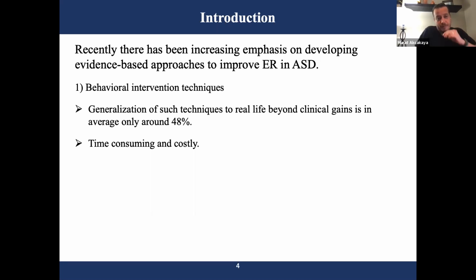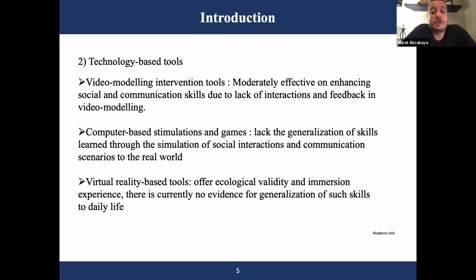So to overcome this, there's a growing interest in complementing such clinical approaches with various low cost and easy to access technology-based tools. This is mainly to improve the therapy efficacy without additional clinician time. Such technology-based tools were also shown to help the target population learn skills of functional living and social communication and interaction. And they are mainly used as self-learning and self-training tools.